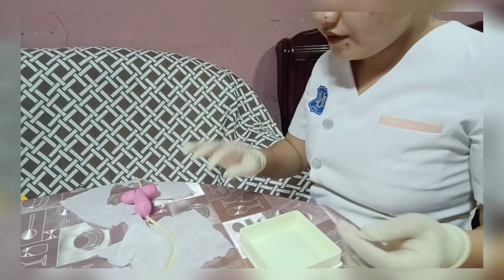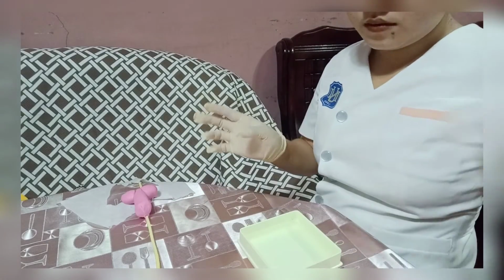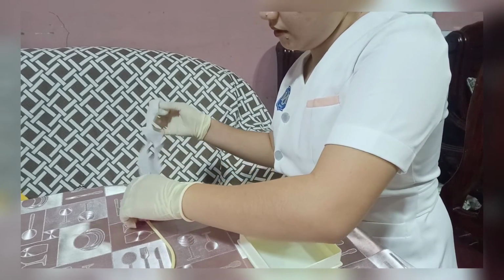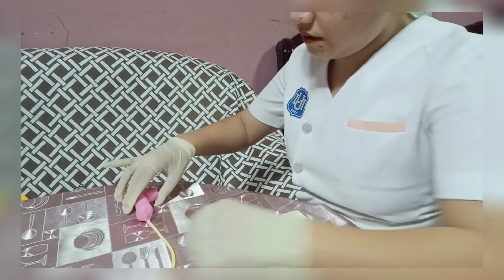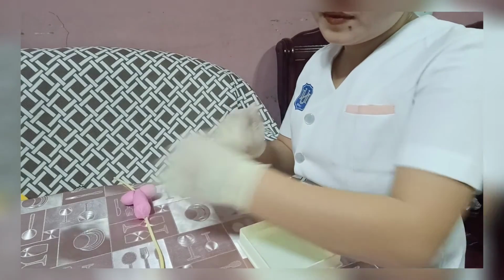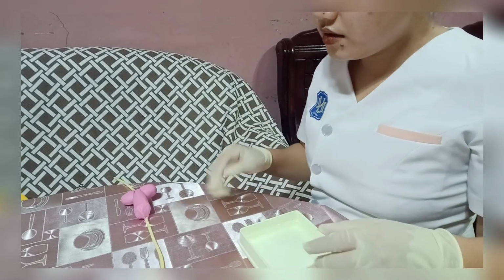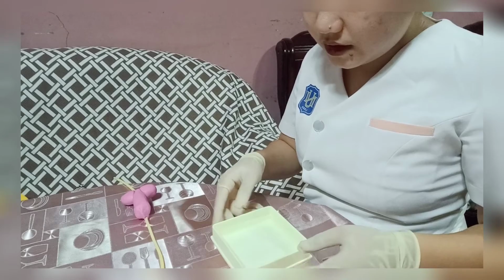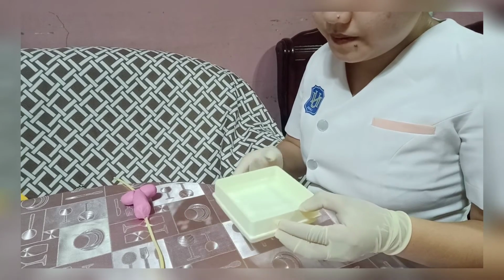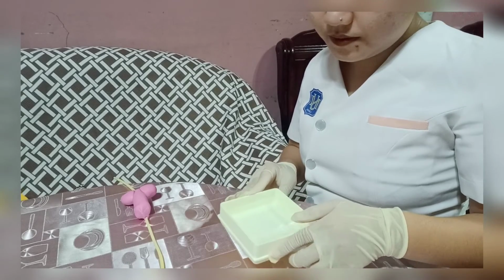Then after that, we have to put away our drape pad. Cover our patient for privacy and comfort, and also dispose of the water from the sink and put the basin in a designated area.